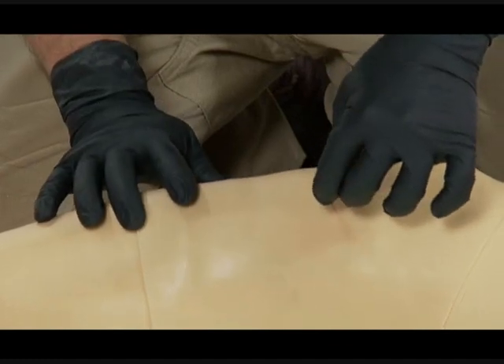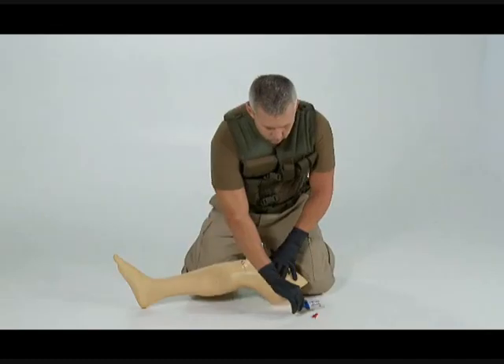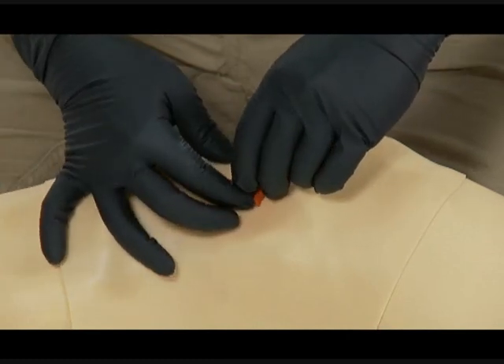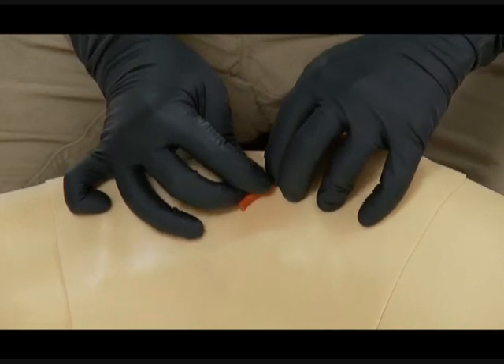Pull out the trocar by pulling upward and twisting. Only the cannula remains in the bone. Always discard sharps such as the trocar into a sharps container. Use the red safety latch to provide additional stability by pushing it around the cannula and taping it down.